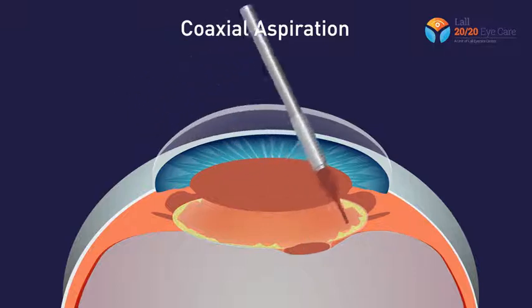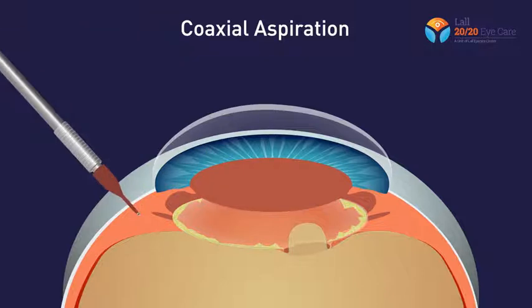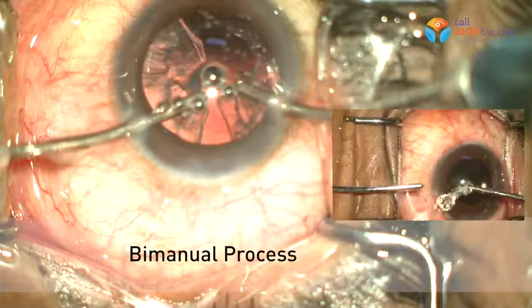This is more so when we tilt the cannula to remove the cortex and the fluid wave directly goes into the vitreous cavity. And yes, if the fluid goes into the vitreous cavity with a force, then the vitreous is certain to come out. When vitreous is mixed with cortex, we have to do nothing but a vitrectomy. Now, finally, what we did.